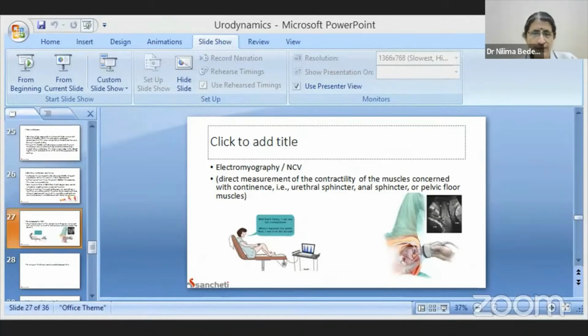We should know the length because that can be another problem when we talk about the symptoms and how to interpret the findings. The time to void on normal uroflowmetry studies depends on how full the bladder is. On average, the flow is 25 ml per second, so it is the volume per time, along with a normal compliance of the bladder. So this is the normal physiology, capacities and pressures with the frequency.